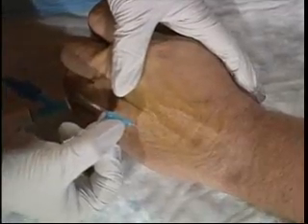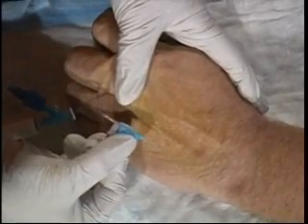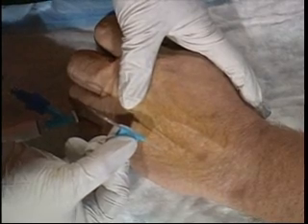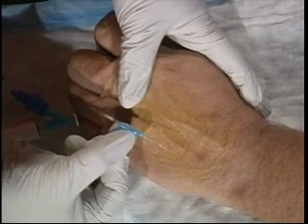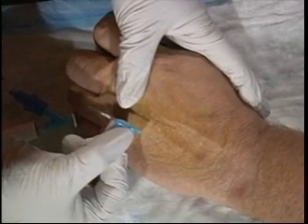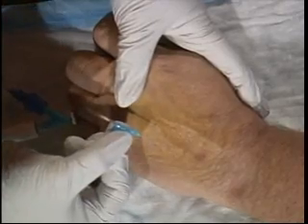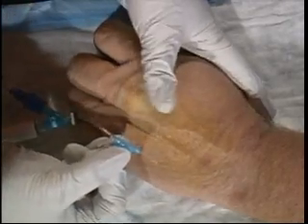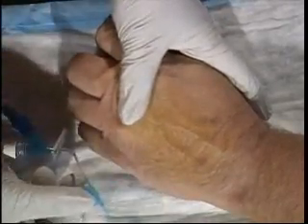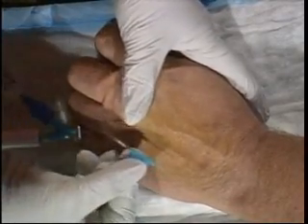I will insert the catheter at about a 35 to 40 degree angle. Once I obtain a blood return, I will then drop my hand down to about a 15 degree angle and basically skim the skin surface. I will not contact the skin because, again, I don't want to drag microorganisms into the venous structure. With my non-dominant hand, I am holding the skin and retracting the vein so it does not move around.